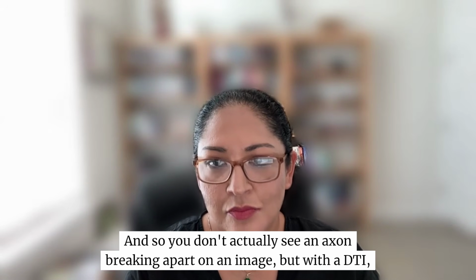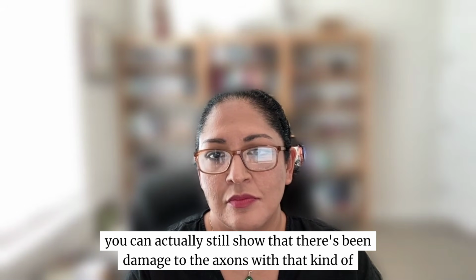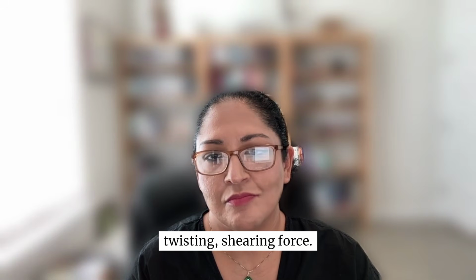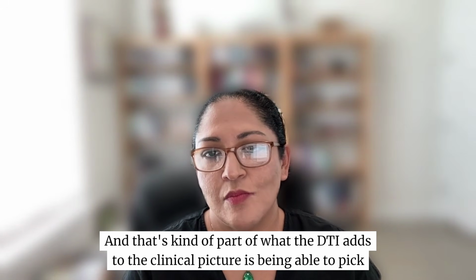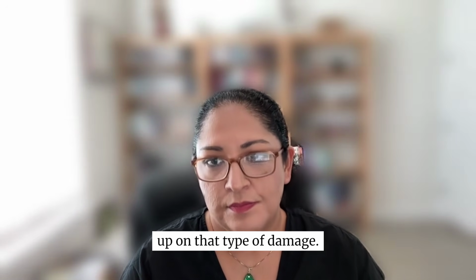And so you don't actually see an axon breaking apart on an image, but with a DTI, you can still show that there's been damage to the axons with that kind of twisting, shearing force. And that's part of what the DTI adds to the clinical picture, being able to pick up on that type of damage.